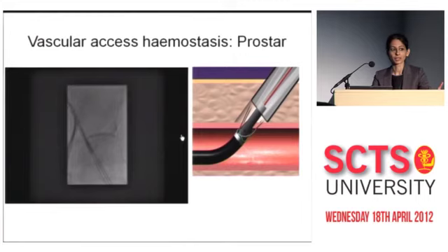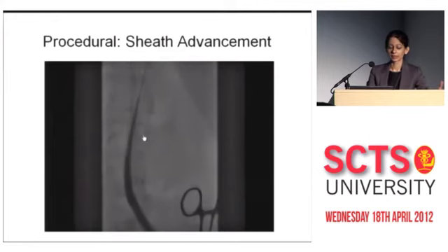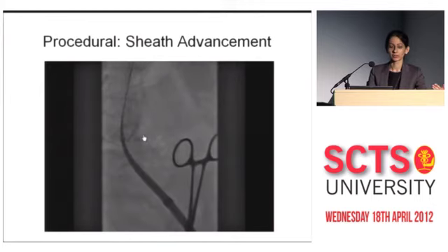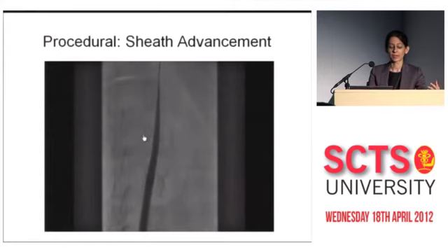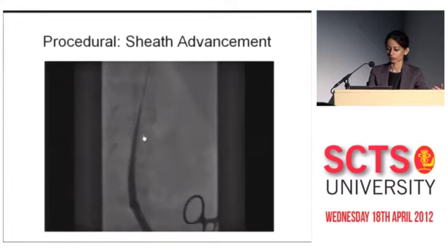The Prostar closure device is a suture-based device using nitinol needles. And again, this is all fluoroscopy based. It really is fluoroscopically driven throughout with respect to the transfemoral approach, and serially dilating with sheaths before going to your actual delivery sheath is often worthwhile in order to minimize trauma. Doing it under fluoroscopy, so you have some sense of the movement of the aorta and the pressure that can be exerted when advancing your sheath, is important.